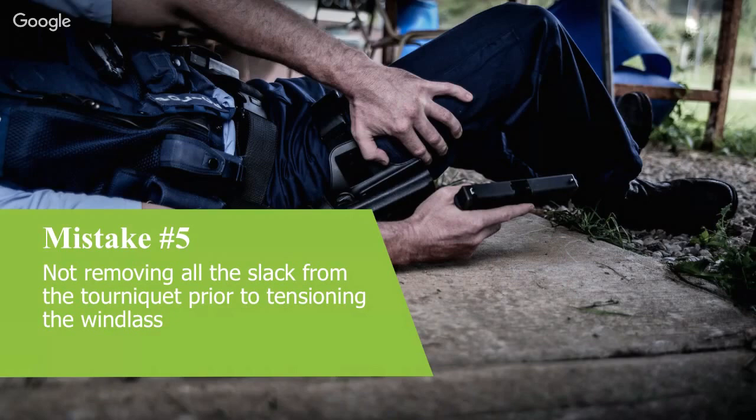And a tourniquet, an arterial tourniquet, will work in venous bleeding. The reason being that you're cutting off the blood flow into the limb, and so therefore you're cutting off the venous supply. So eventually the venous blood will leak out, but there's no more coming into the wound to leak out. So an arterial tourniquet will stop heavy venous bleeding, but tourniqueting a venous bleed is not technically appropriate.